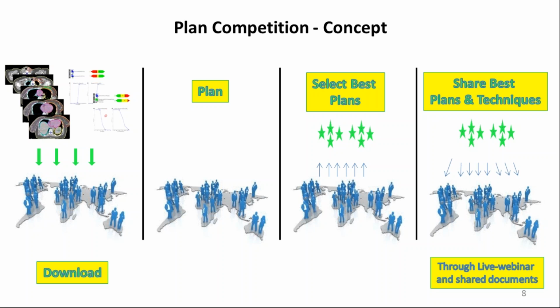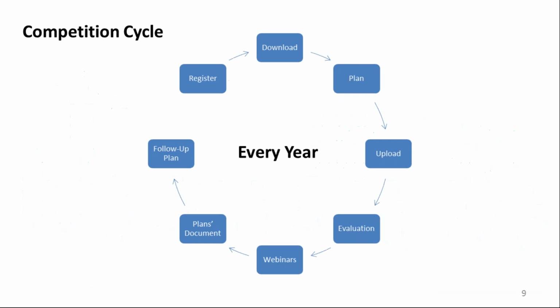and they will use these guidelines, or tips and tricks from the best planners, to try to replan the actual plan that was in the competition, in order to see whether they could improve or not. I'll be talking about this follow-up in the coming slides.